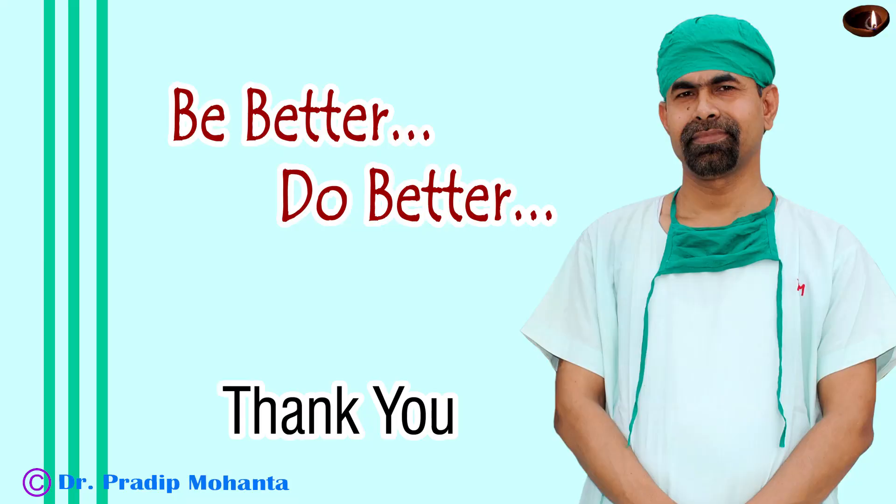And the case is concluded. Thank you very much for your attention. This is a totally unedited recording and you have watched each and every step of the surgery. We have completed the surgery in about six minutes, but it was not done in a hurry. So if we increase our surgical skills, the surgery will be fast but it will be safe.